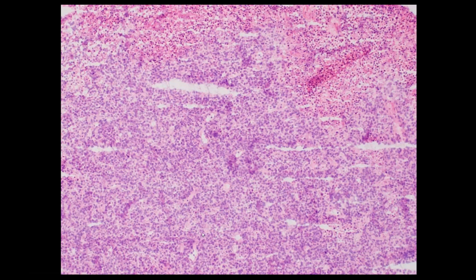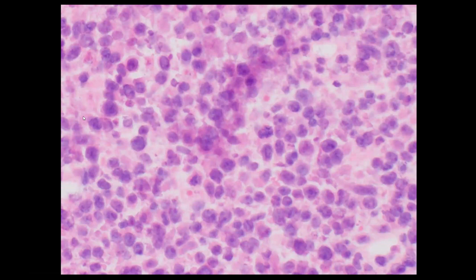So what happens, the patient goes to surgery, and they are going to try to resect the mass, but they first sent you this biopsy. You can see here from the low power, there are no normal structures. The entire mucosa is replaced by this proliferation of cells, and you have necrosis on the surface. If you look close, those cells are very pleomorphic, with prominent nucleoli and a good amount of cytoplasm, and some hint of plasmacytoid or rhabdoid features. Hard to say exactly what these cells are.